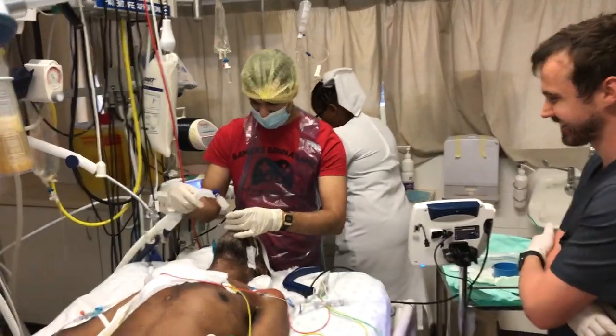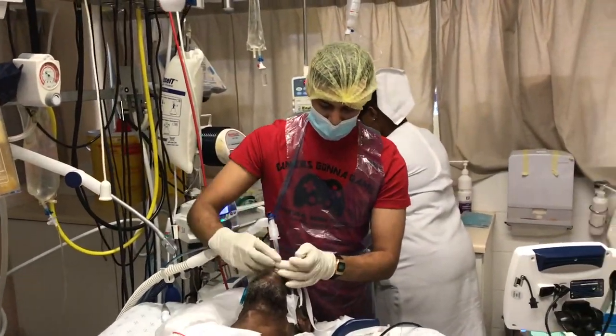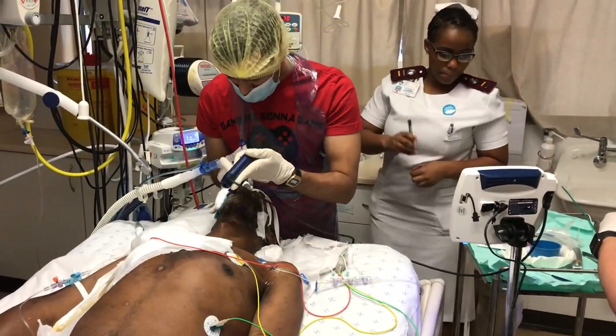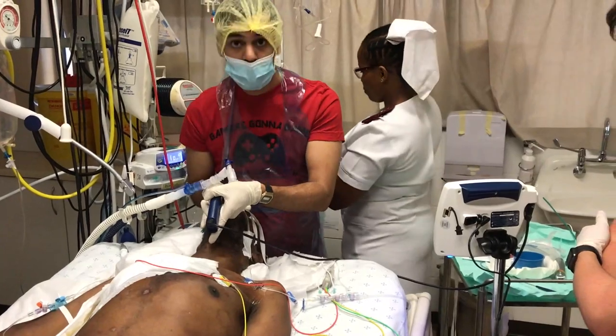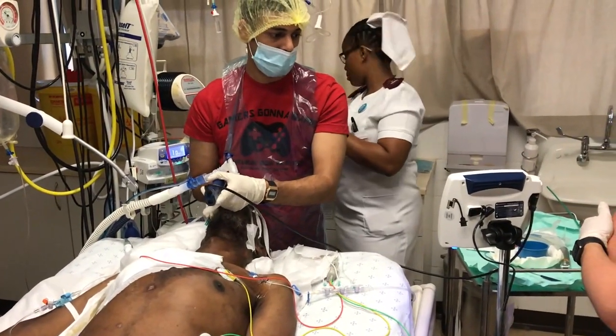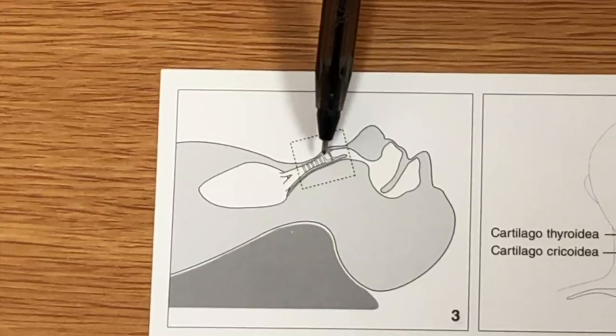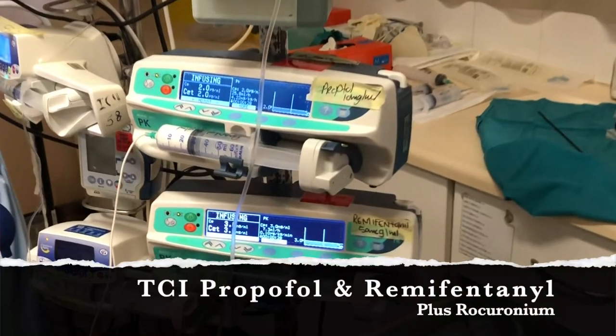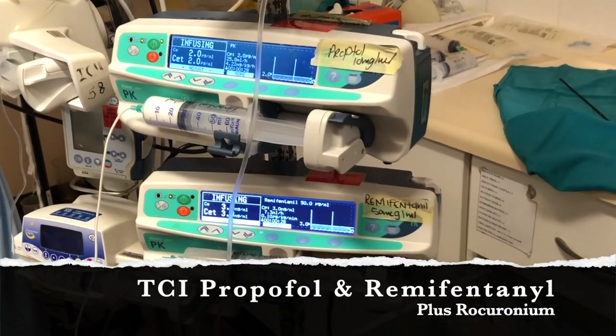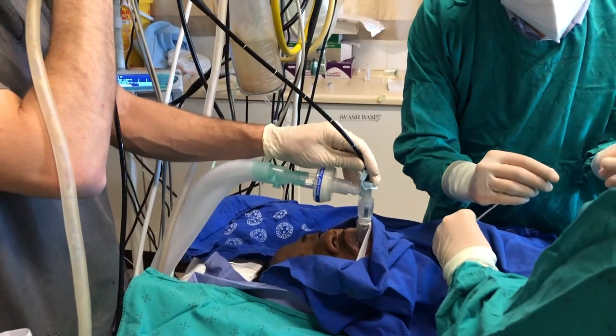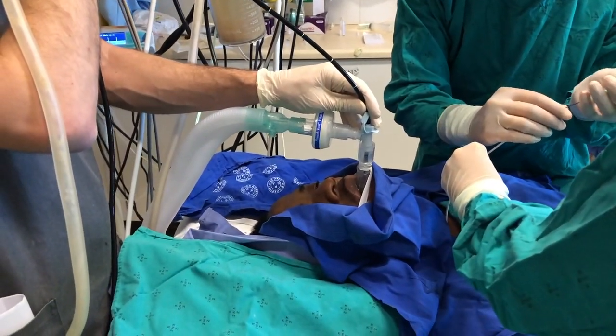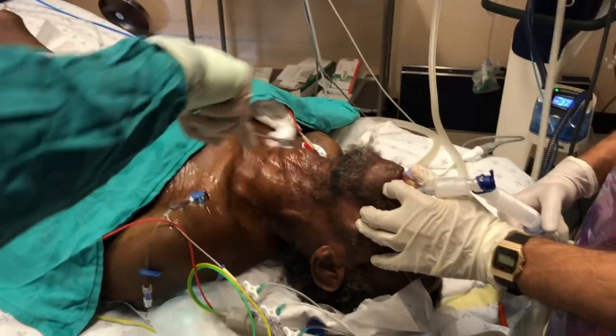Options for endotracheal tube management: withdraw the existing tube to just above the cords, inflate the balloon and hold it there. Second option is to intubate the patient with a smaller tube like a size six that is sited just through the cords and typically will not occupy the trachea. The final option is a supraglottic airway, but because of the extreme neck extension required, supraglottic airway does not always seat well.